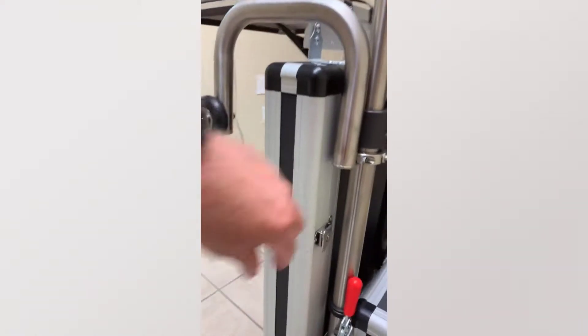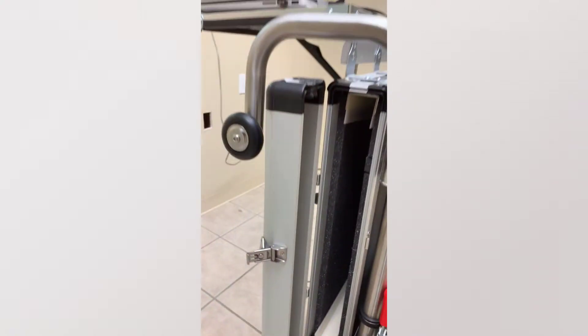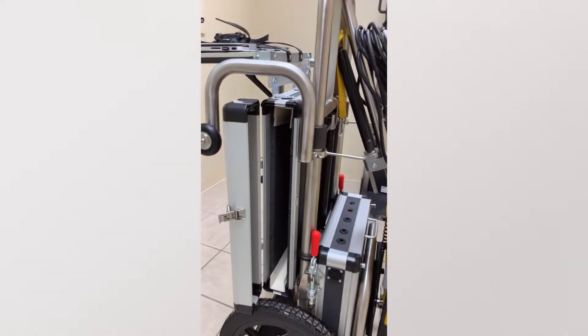You also have a storage bin to put the panel in it. You can put a panel, case, laptop, whatever in there if you're moving it locally.